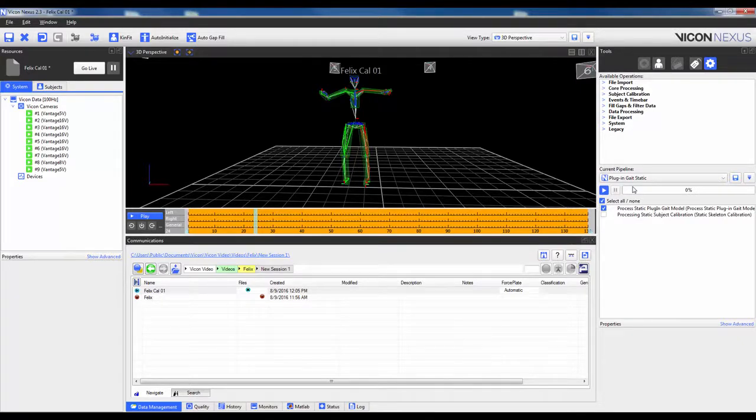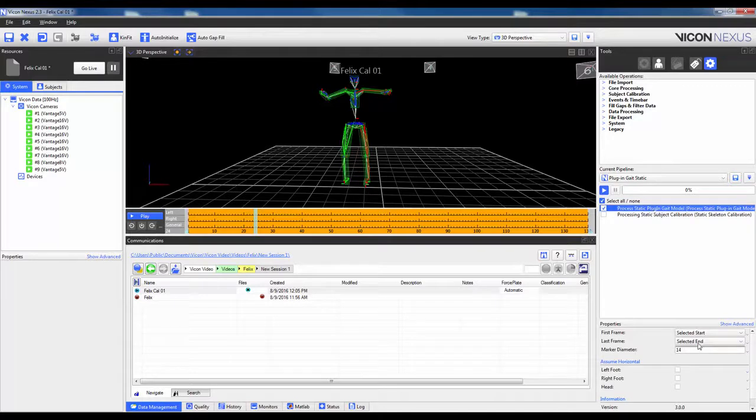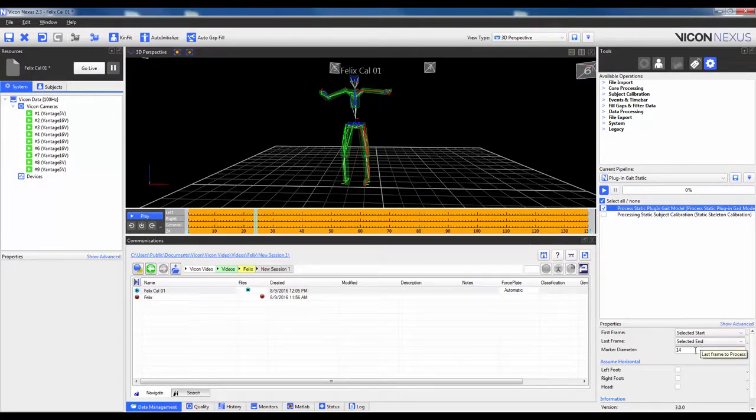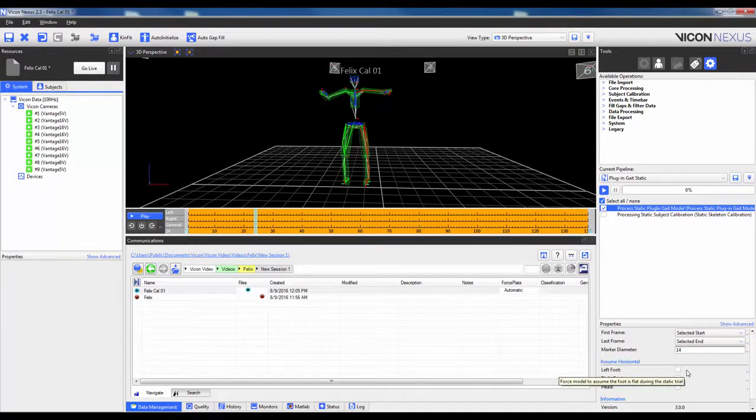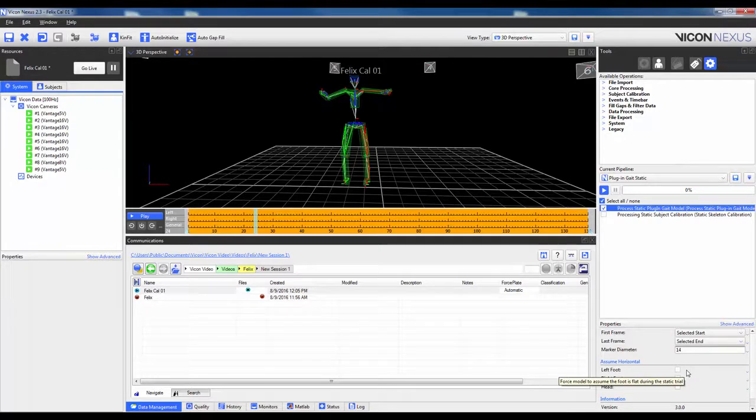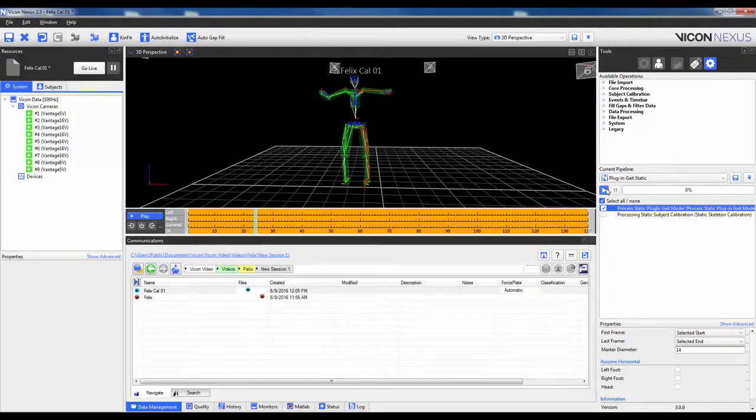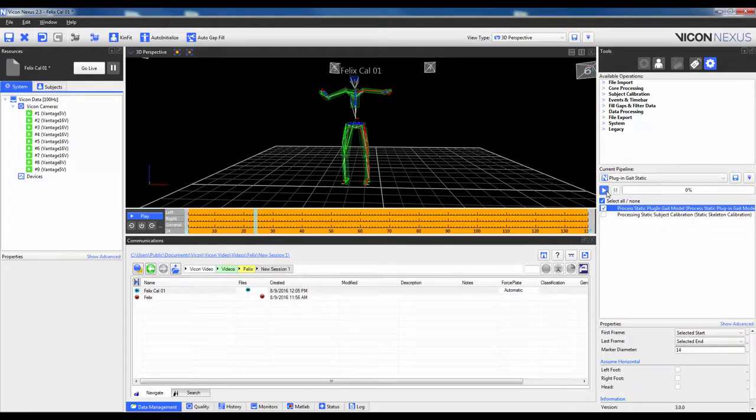Before processing it, there are a few settings that we can change, so if I highlight it, the properties are down below. The marker diameter should reflect the size of the markers used, and the Assume Horizontal will adjust the orientation of the particular segment to be parallel to the XY plane, even if the marker suggests that the segment is not. When you are sure that the settings are correct, go ahead and run the pipeline, so I can just run the entire pipeline operation here.